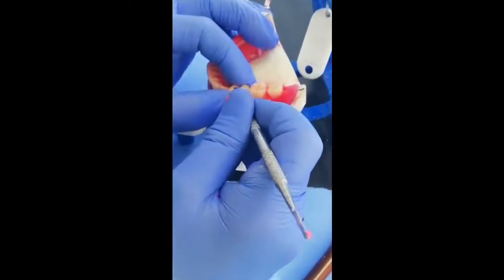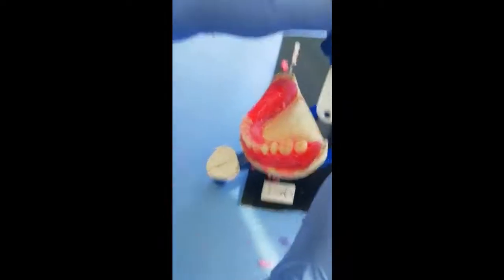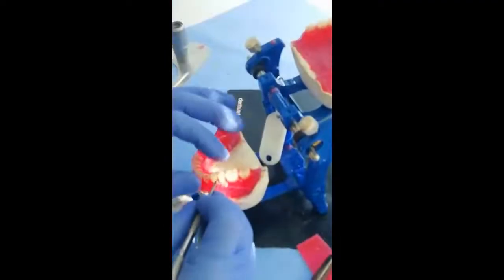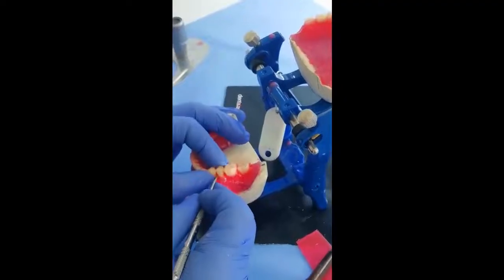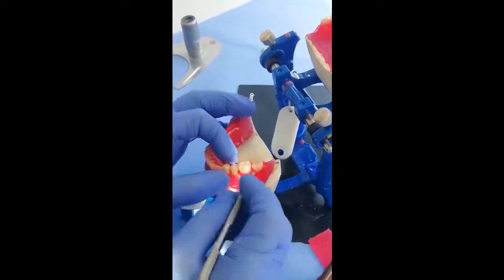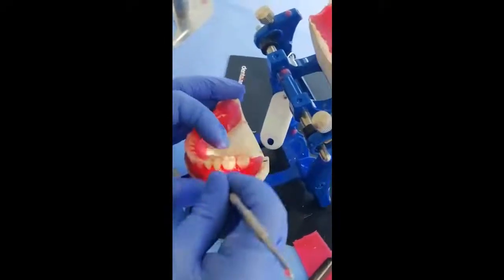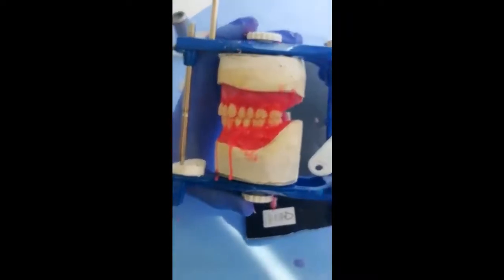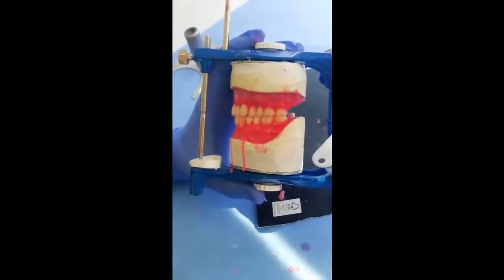And this is because we have a broken contact here and a light contact between the mandibular or maxillary posterior teeth. Now we fix it in its position, and we can see that it occludes perfectly in its position. Now all what we need is to fix these teeth.